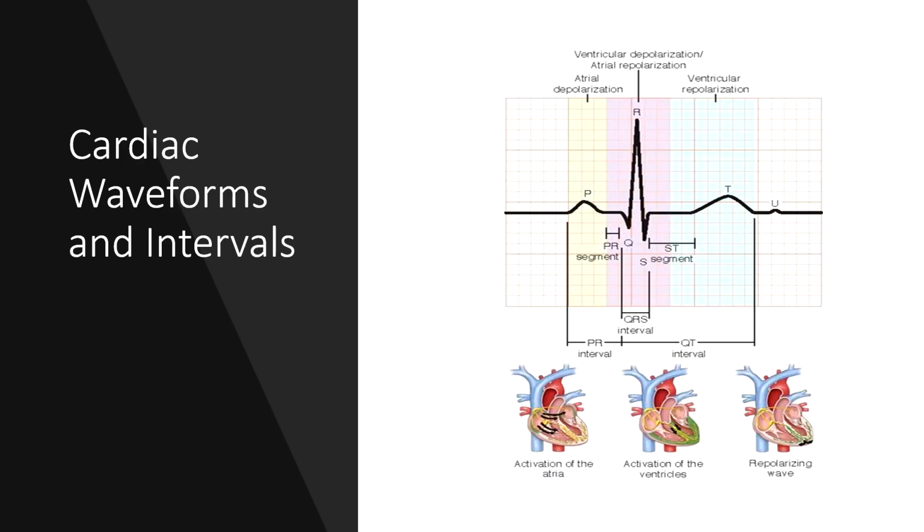And then looking at our EKG rhythms, we are going to be looking at our P wave, QRS, and then our QT interval. Some patients might have a U wave too. So depolarization, movement of ions before contraction, facilitates cardiac contraction. Repolarization is the movement of ions back to the resting state. Our P wave corresponds with atrial depolarization. The impulse from the SA node through the atria produces contraction.